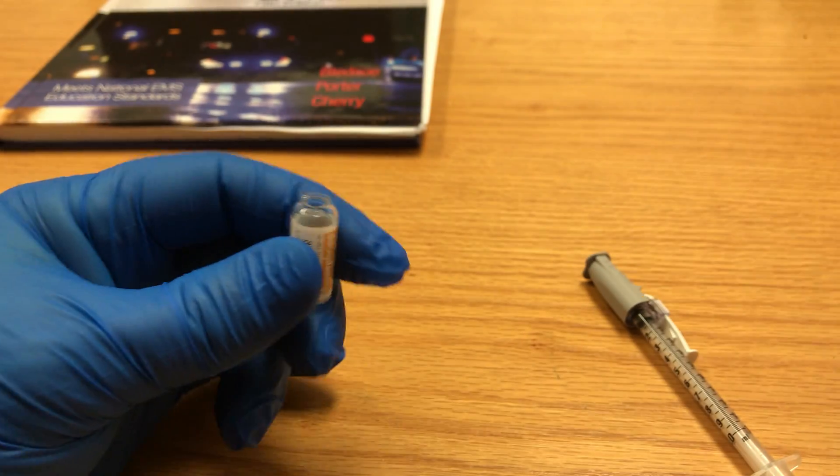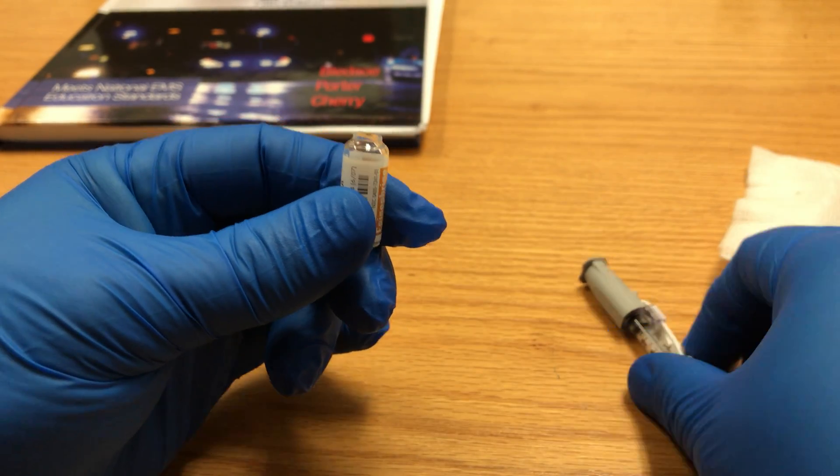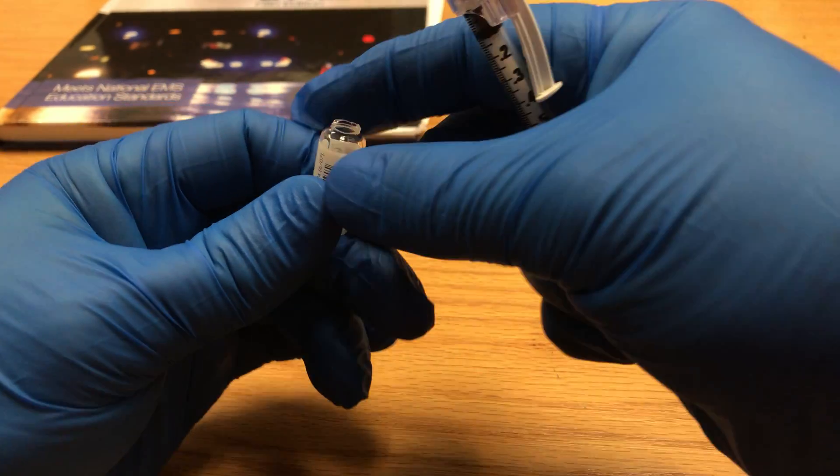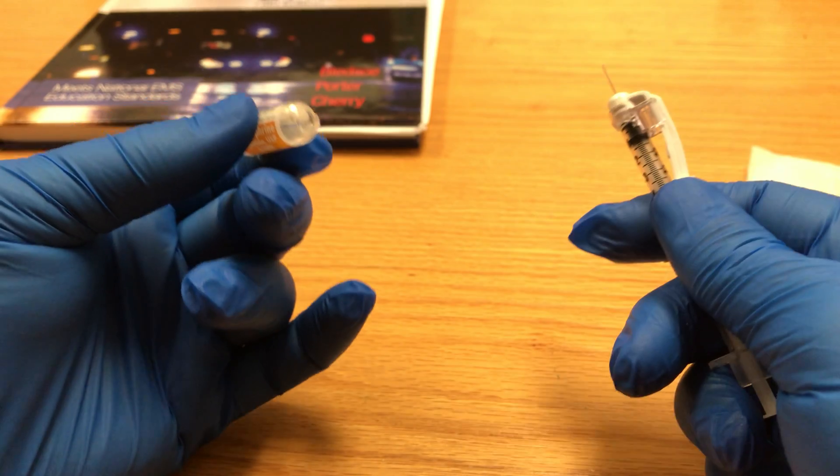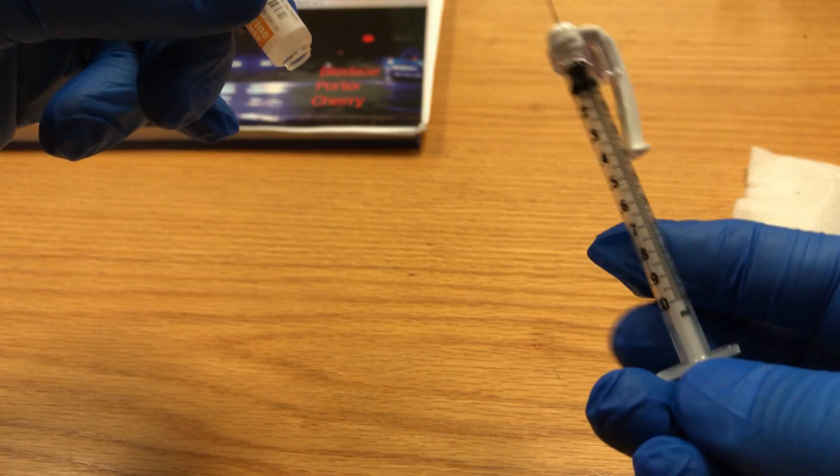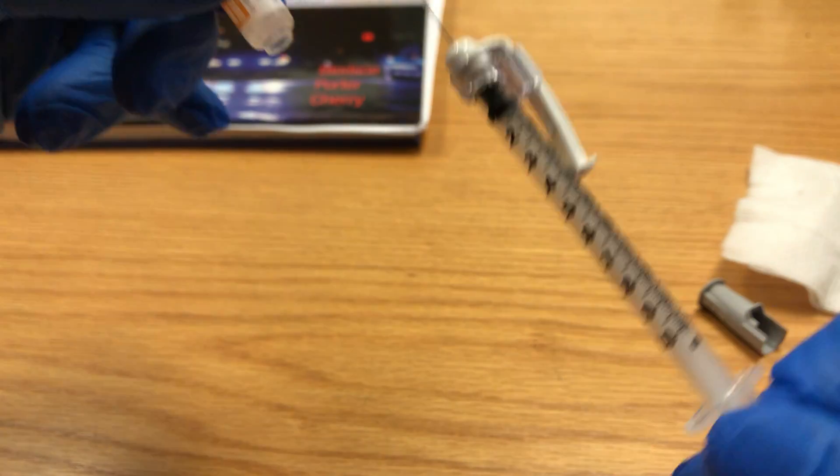This I typically put in the sharps container, and now I have my ampoule with my medicine. Take the cap off of my syringe. One of the cool things about ampoules is you can actually turn it upside down and it won't come out. Because I want to be able to get all of the medicine out, I can insert my needle right into the bottom and start withdrawing all of the medication.